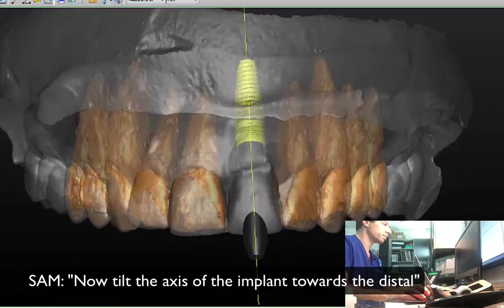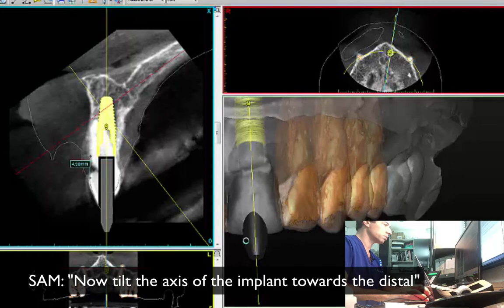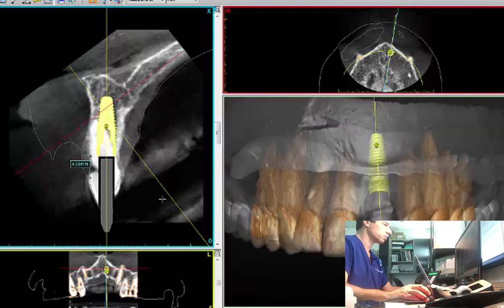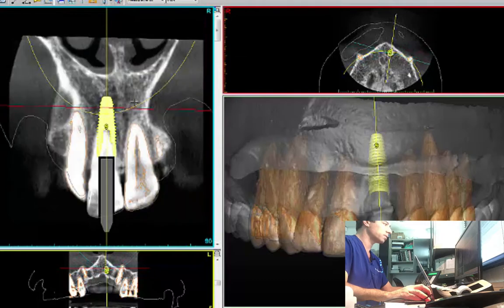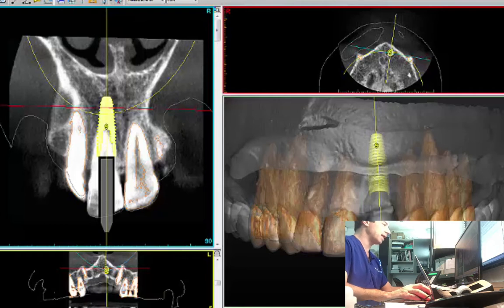Now, since the implant — you want the axis of the implant more towards the distal. So I'm tilting the axis of the implant towards the distal. So when you say that, you want the apex a little bit to the distal, right? Alright, okay.